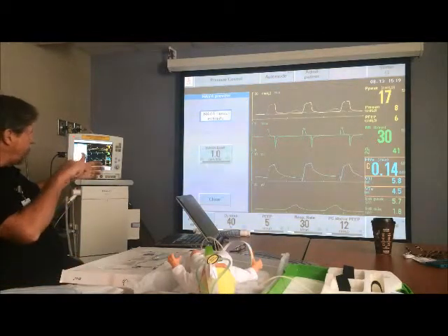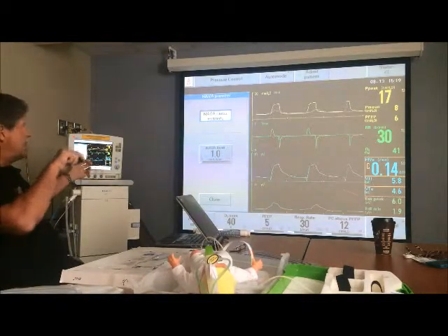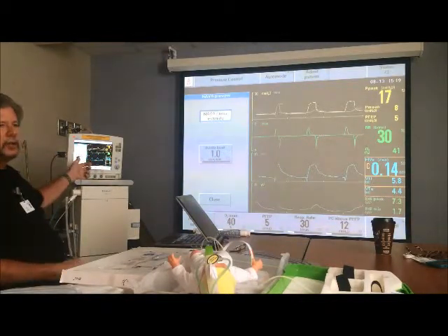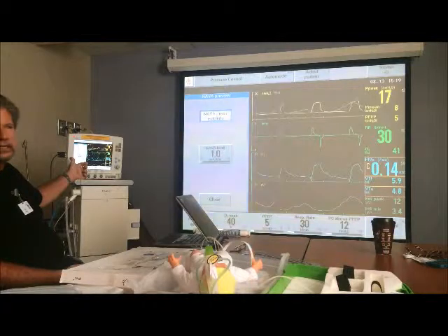So in this case, if we were in NAVA and this patient's EDI, let's say, was always 6, he'd be getting 1 times 6, or 6 centimeters of pressure support every breath. Okay, that makes sense to you guys?